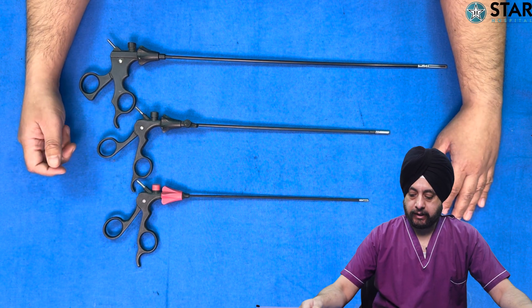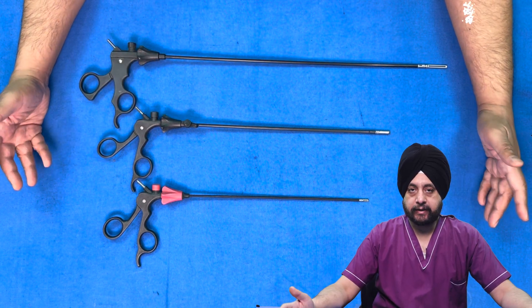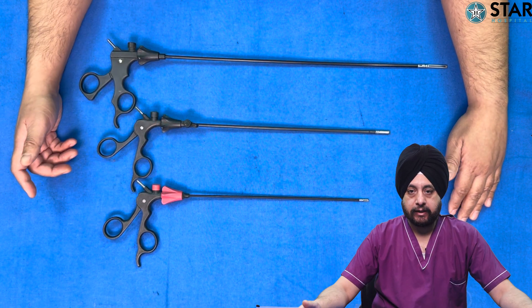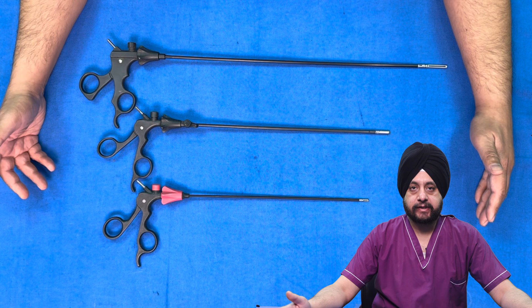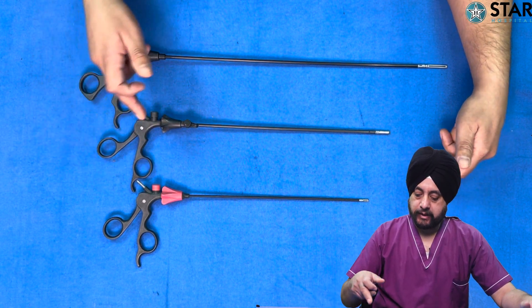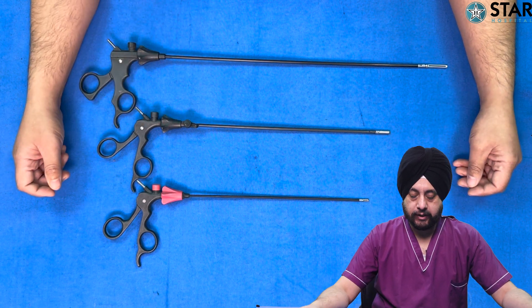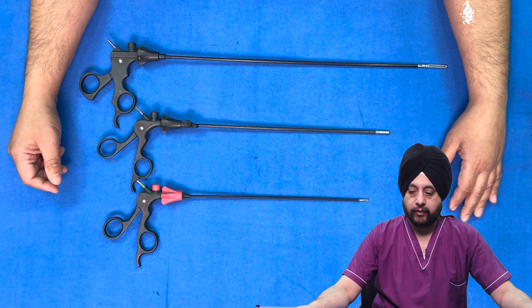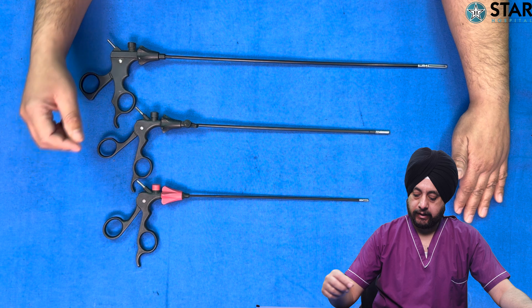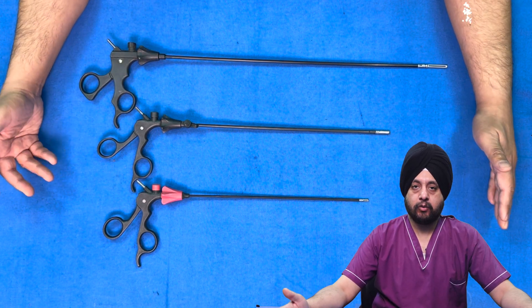Here are a few examples: the one on this edge is a little longer, used usually in bariatric surgeries or for patients who are very obese. The one in between is what is used routinely, and the smaller one is for pediatric surgeries or mini laparoscopic surgeries. The length of a routine laparoscopic instrument is measured by the length of the shaft, which varies around 33 to 37 centimeters. Pediatric instruments are less than 30 centimeters, and longer instruments are usually more than 40 centimeters — this one here is around 42 and can go up to 45 centimeters.